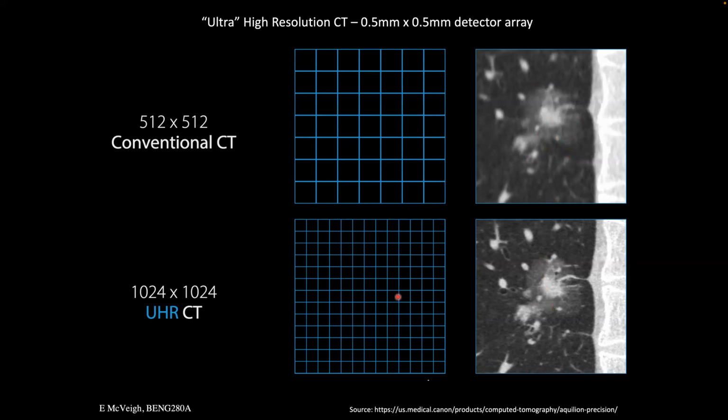And this is what it looks like with this new detector, right? And, question, can you see new things? Well, if you look at these small airways, this little airway here, this airway here, also there's one here, there's one here, there's one here, and these tiny vascular structures here, the airways certainly are just not visible here.